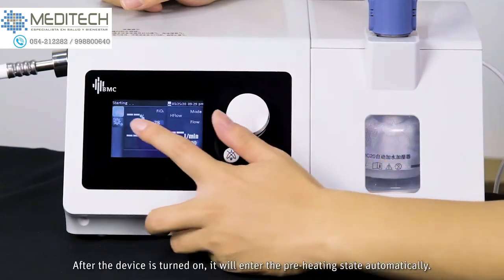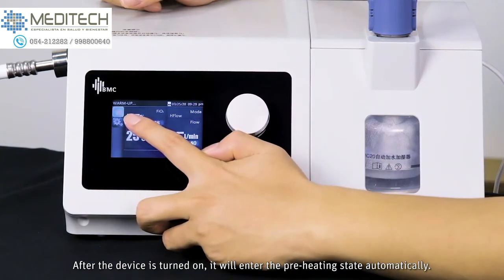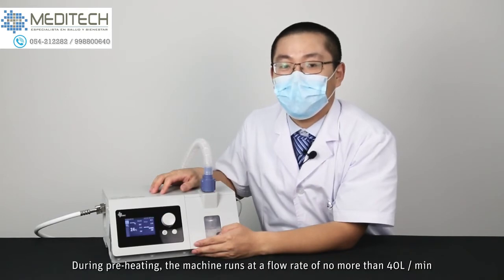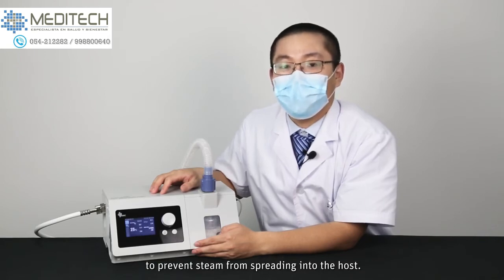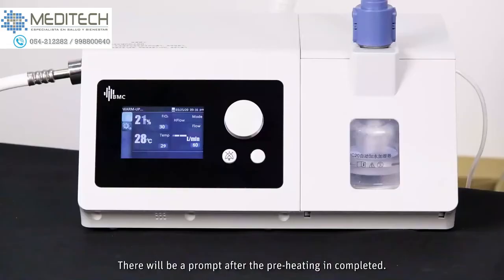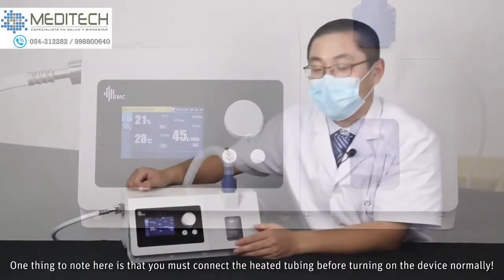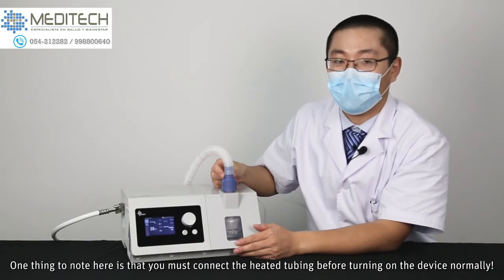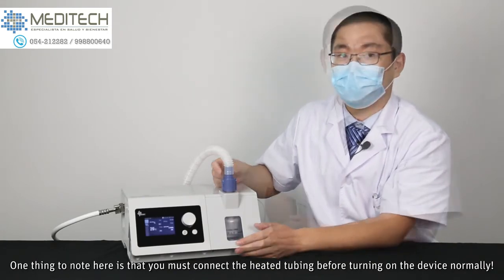Start the device by long pressing the knob. After the device is turned on, it will enter the preheating state automatically. During the preheating, the machine runs at a flow rate no more than 40 liters per minute to prevent steam from spreading into the host. There will be a prompt after the preheating is completed. One thing to note here is that you must connect the heated tubing before turning on the device normally.